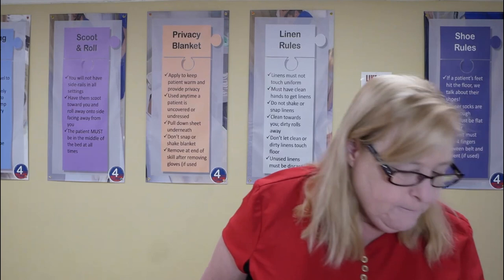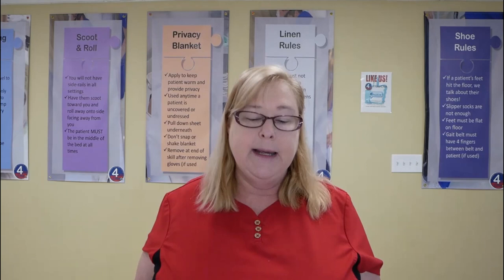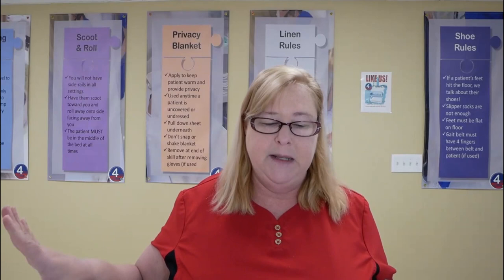Yes, I have a question. When you mentioned being careful with the bacteria getting into the catheter and the urine bag, did you mean inside when we empty the bag or outside? Okay, so the next skill that we go over will be emptying the bag. I've got a whole lecture to give you on that. What I'm saying right now is just don't separate the two pieces, the catheter from the tubing. That's not what CNAs do, and we've got to keep the outside clean. We're going to talk about the inside being clean in just a few minutes when we talk about emptying that bag. Good question.